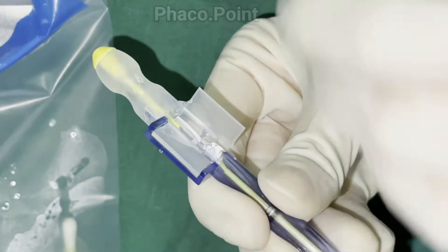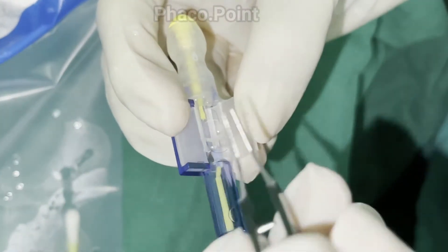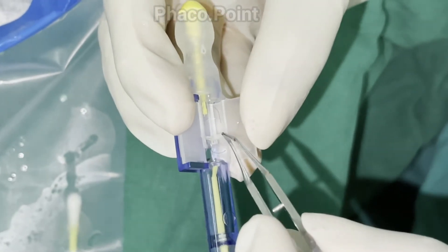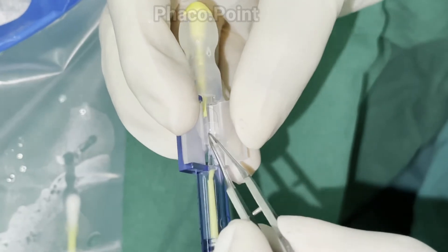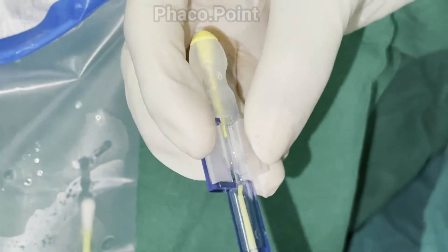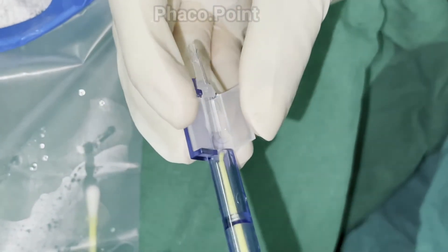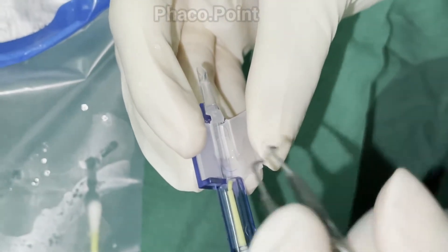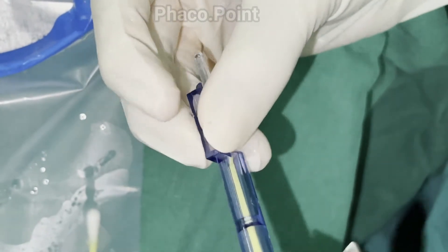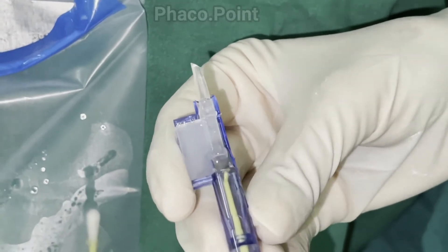The covering plastic is then removed, and whilst stabilizing the injector system, ensure that the orientation and positioning of the lens is optimal. The nozzle protector is then removed, and under clear visualization under the microscope, one must attempt to shut the cartridge.